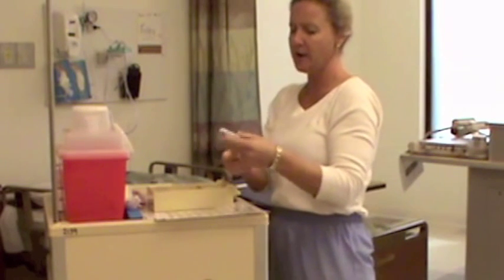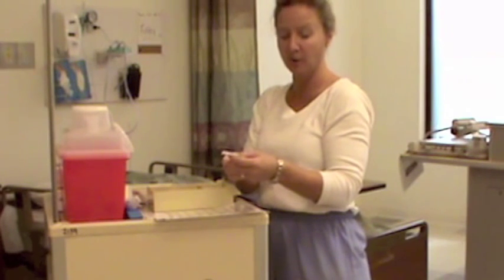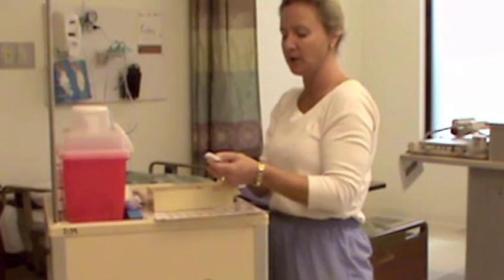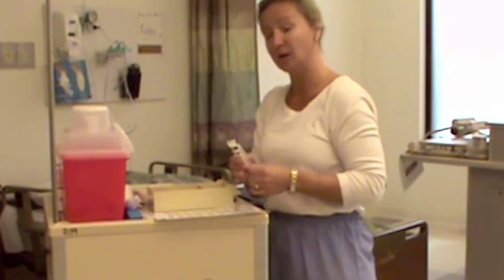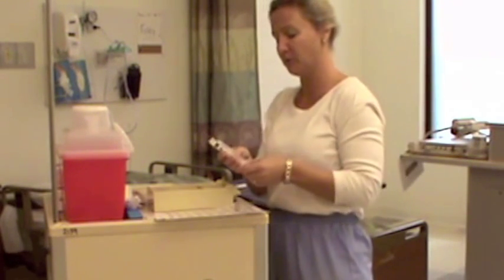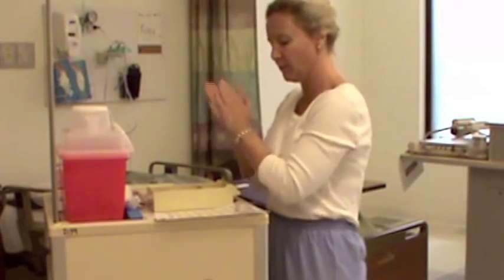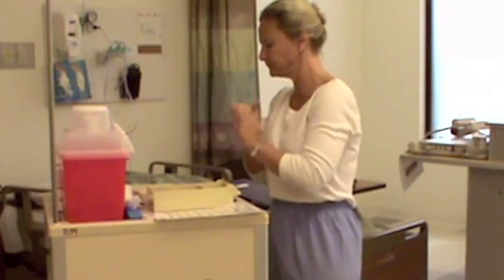Here I have a 3 milliliter syringe, and it's a 22 gauge. The gauge for an intramuscular injection should be from 25 gauge to 20 gauge. This is a 22 gauge, and it's 1.5 inches long. I am going to go into Mr. Ito's ventral gluteal area, so 1.5 inches is a proper length for Mr. Ito. This is not expired. Then I'm going to wash my hands, and I'll have gloves when I get in the room. Then I'm going to begin to prepare my medications.